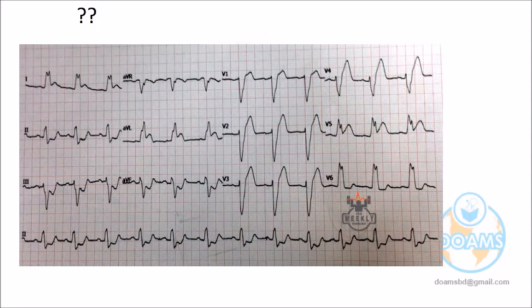Interestingly, I have some patients who don't have any symptoms. Usually, you know that RBBB is a common variant, right, Dr. Ibrahim? RBBB is a common variant. But a few patients I observed, and I shared with a cardiologist for opinion also. I have gone through very little literature about that. LBBB-like ECG may be asymptomatic, but LBBB is very dangerous. LBBB means immediate correction is needed, but without symptoms, it is possible. So this is LBBB.